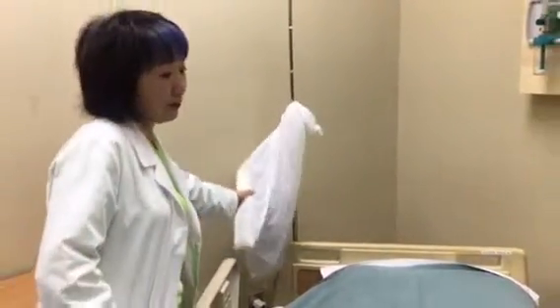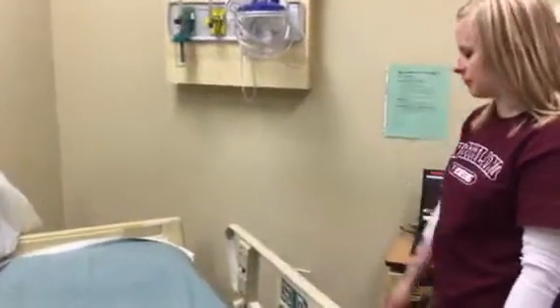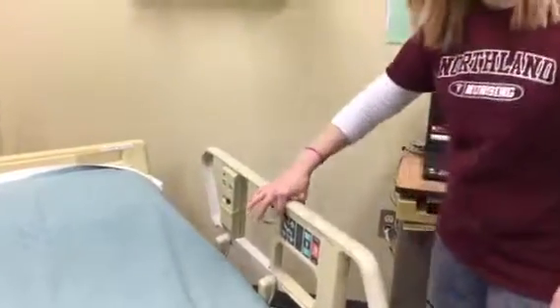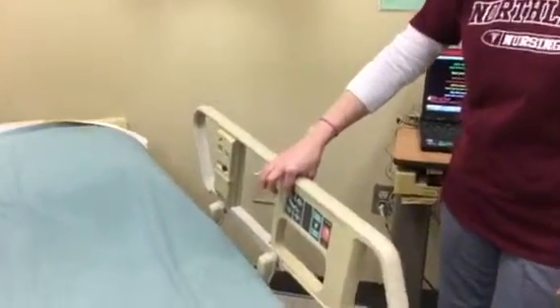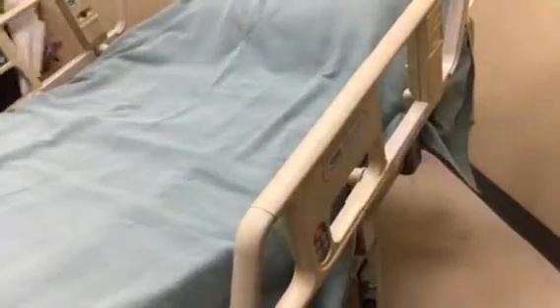So Lisa, if I'd like to have the patient raise the head of the bed, which button should we push? So you can either be on this side, so the patient could put their head up, or if you're on this side, there's also a button right by the red nurse.